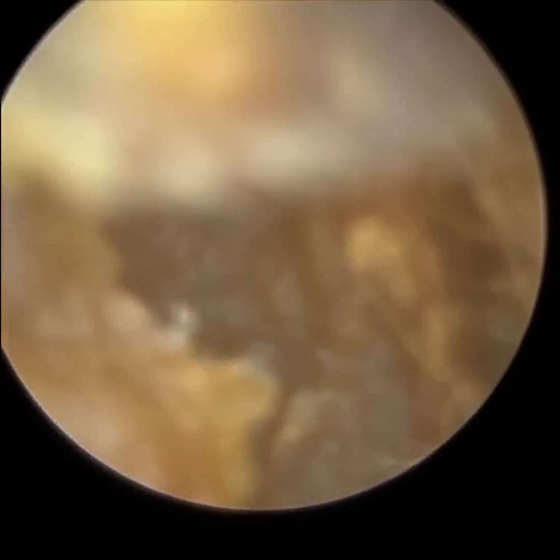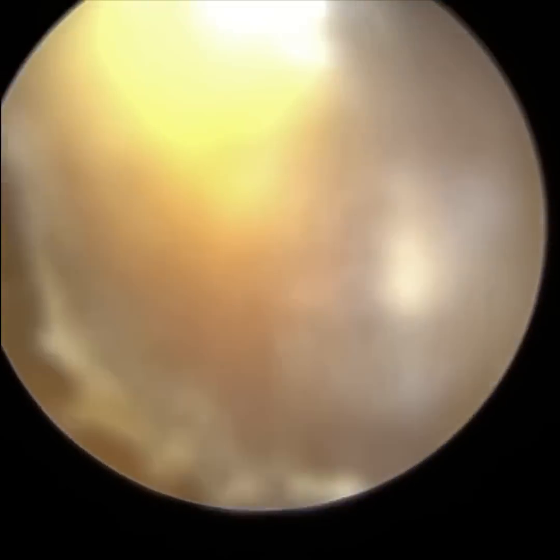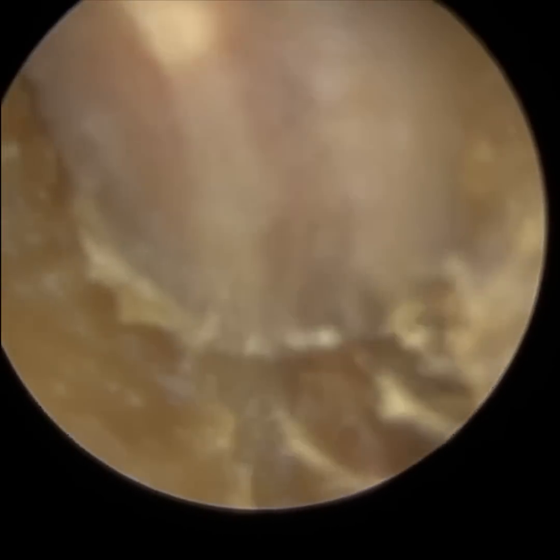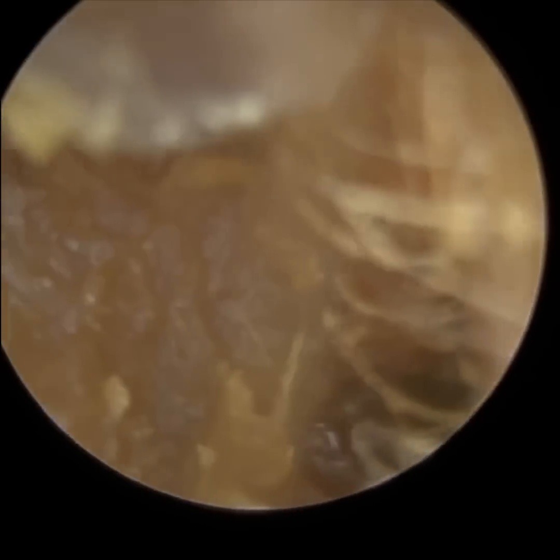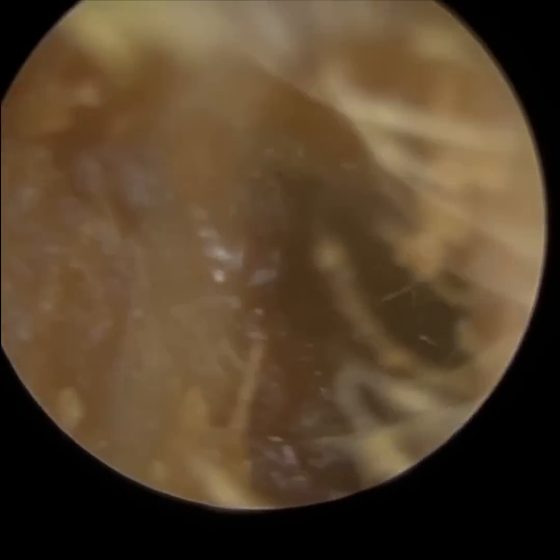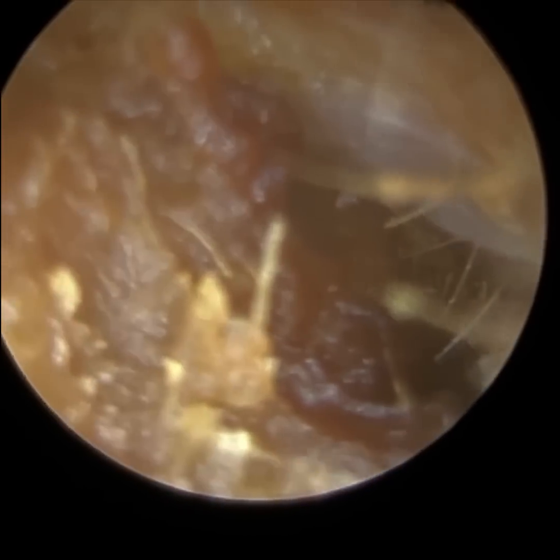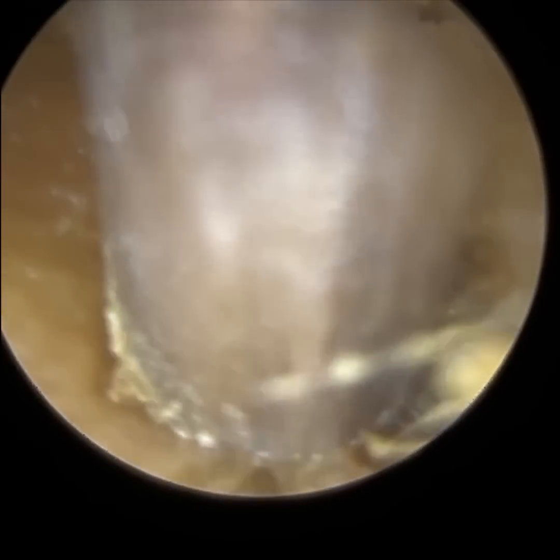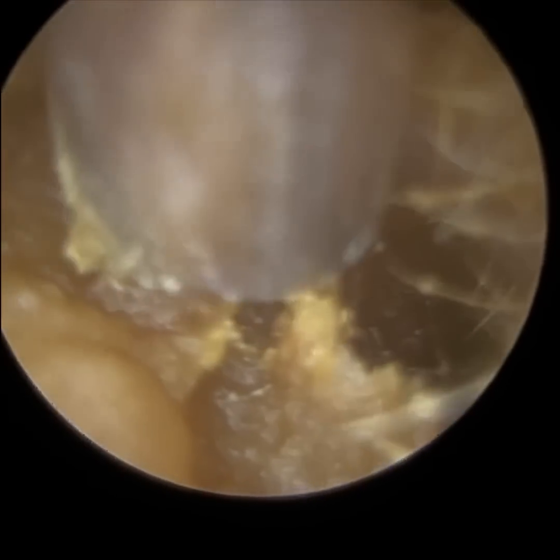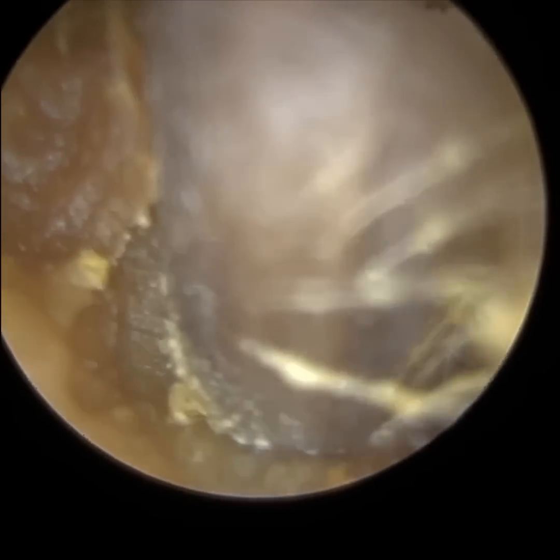And I suspect there's two reasons why this patient's suffering from earwax impaction in their right ear and not their left. In comparison to their left ear, this right ear has got near the entrance a little trench, a little pothole if you like. So I suspect as the wax is trying to naturally migrate out of the ear, it's falling into this pothole, this trench that this patient's got at the beginning of the ear canal. It's almost like a step down. So as wax is migrating sideways, it falls down that step and then it's difficult for it to come back out.